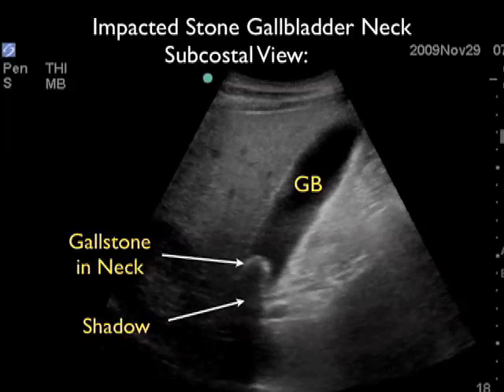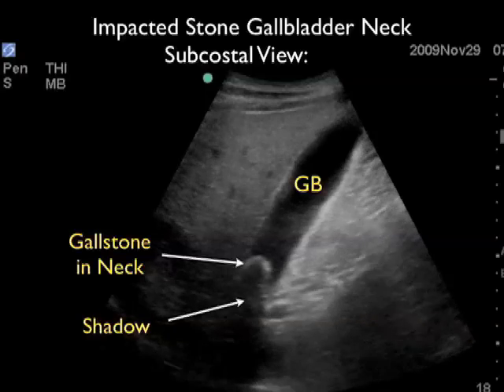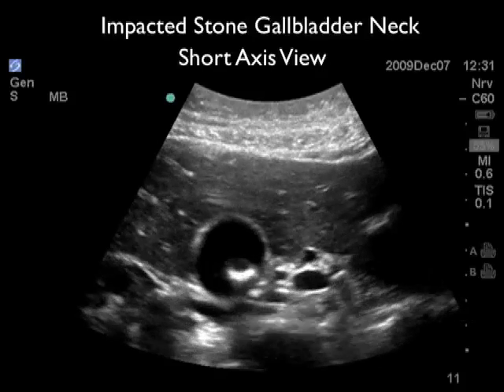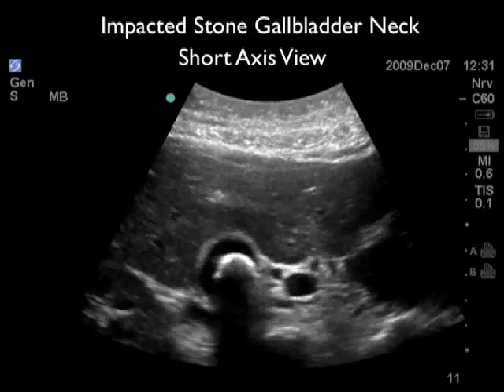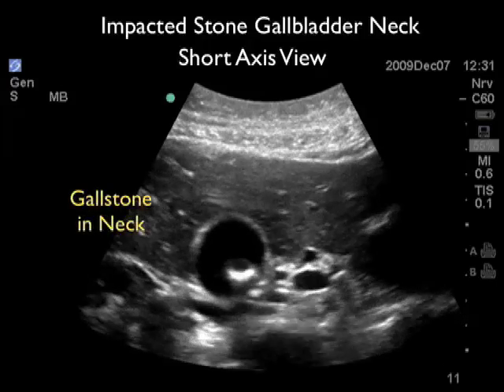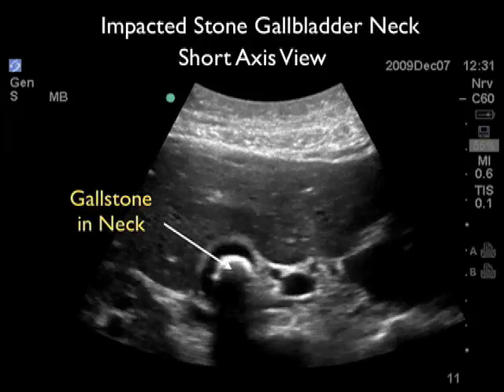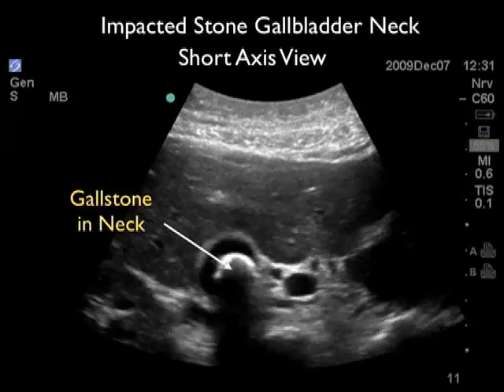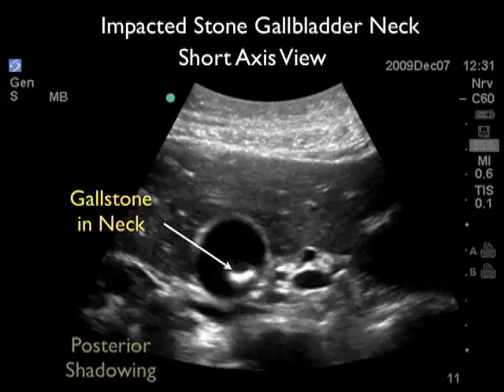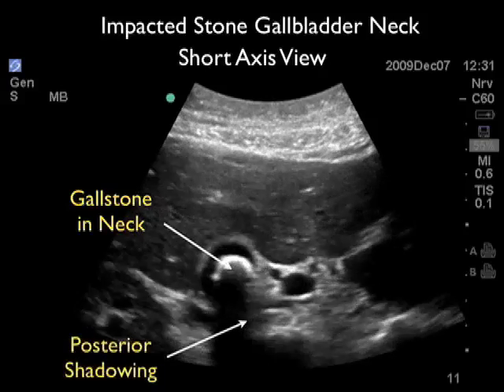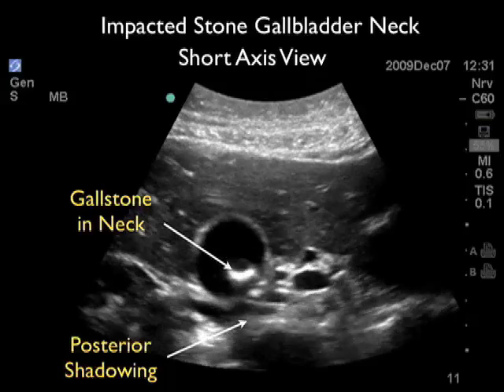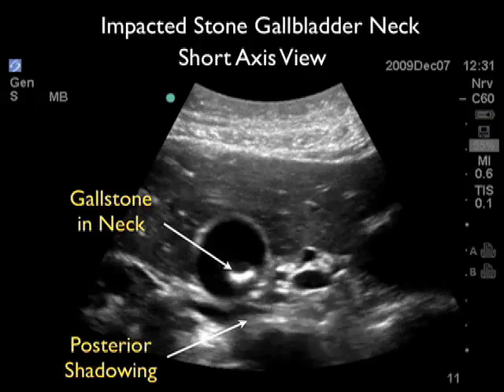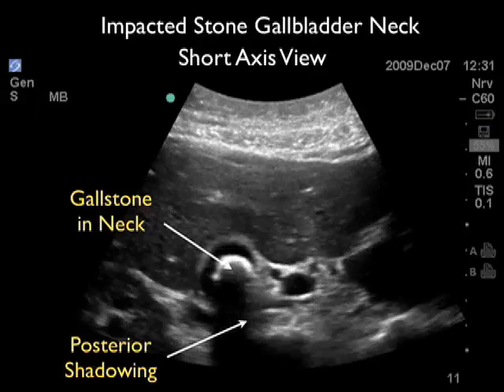As we press down on this gallbladder, the patient had a lot of pain, confirming a sonographic Murphy's sign. Here we're going to change the orientation of the probe into a short axis configuration. The probe is located in the subcostal plane with the marker towards the patient's right, cutting the gallbladder into cross-section so it appears as a circle on the ultrasound screen. We see the gallstone — that hyperechoic area within the gallbladder lumen — and again the posterior acoustic shadowing confirming the presence of a gallstone.